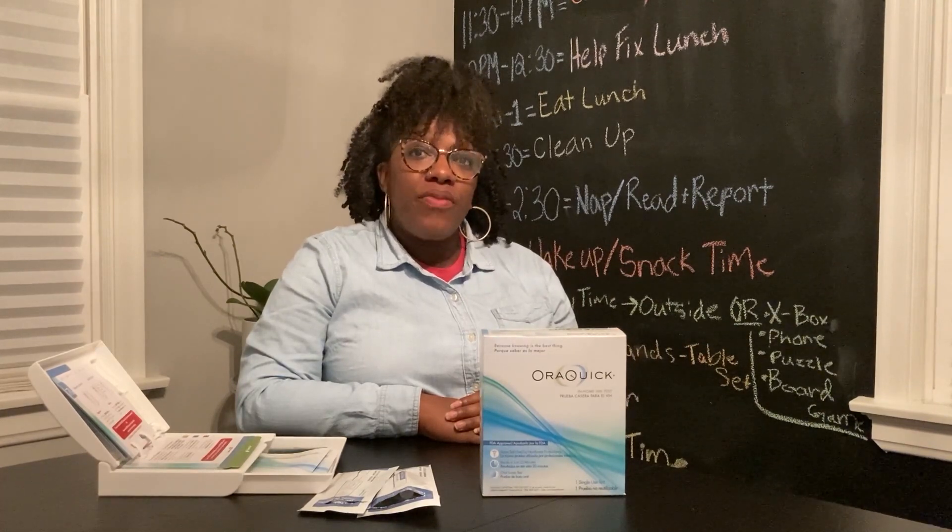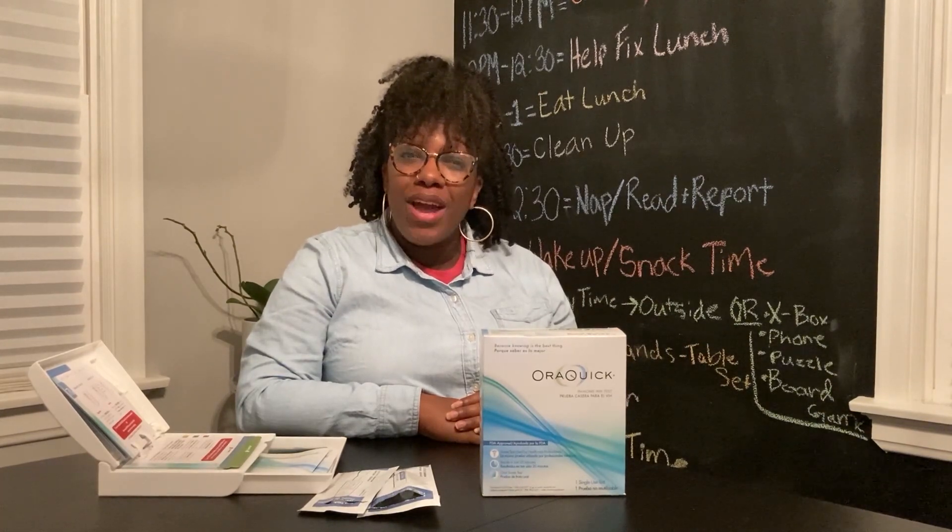We'll be using a rapid self-test, but there are some other types of self-tests too. You can buy a rapid self-test at your pharmacy or online. Some health departments and community-based organizations also provide rapid self-tests free or at a reduced cost.